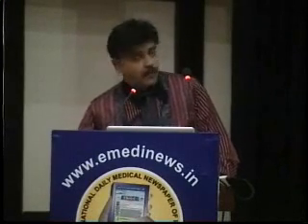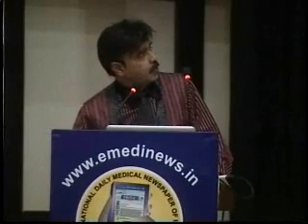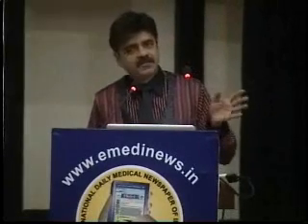This is a residual thyroid post-surgery which needs to be radioiodine ablated. We did a sestamibi scan, and apart from the residual thyroid, there are many malignant nodes that are present. We did radioiodine ablation, and all the nodes are gone now. So in a thyroid scan, the patient can have a nodule which could be a toxic nodule, which could be a malignant nodule, which could be just a colloid goiter, all these things can be differentiated on a thyroid scan.